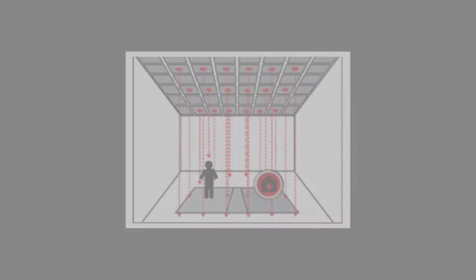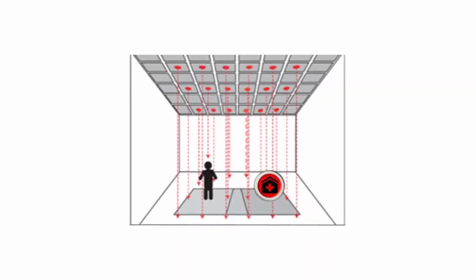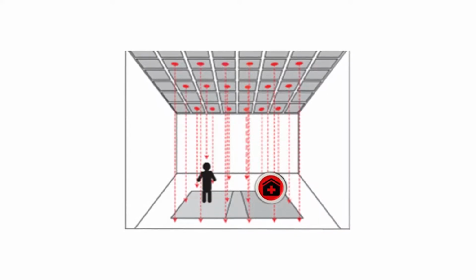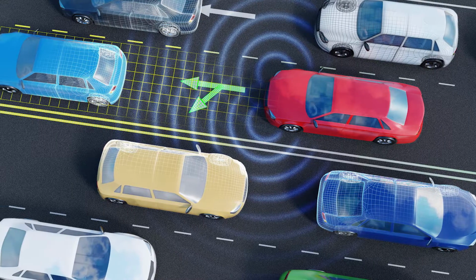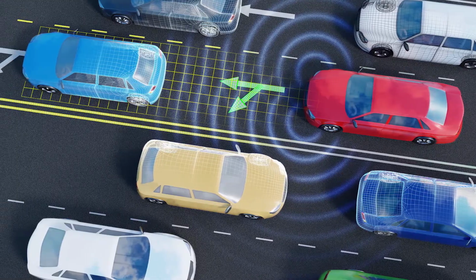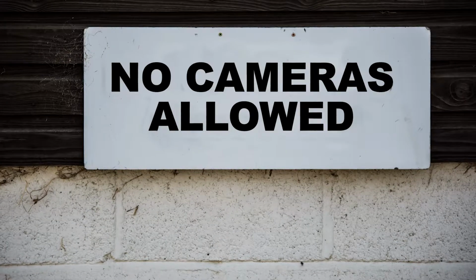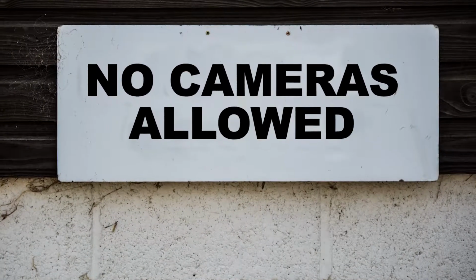Researchers at the LESA Center at Rensselaer Polytechnic Institute are working to solve the camera conundrum in healthcare settings by demonstrating how a small network of low-cost, time-of-flight sensors uses speed of light to measure distances. The technology is similar to automotive LiDAR used for self-driving cars and offers an inexpensive, cameraless monitoring solution for health and wellness facilities.